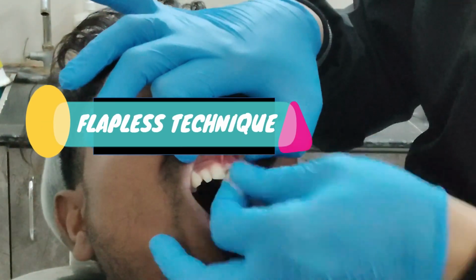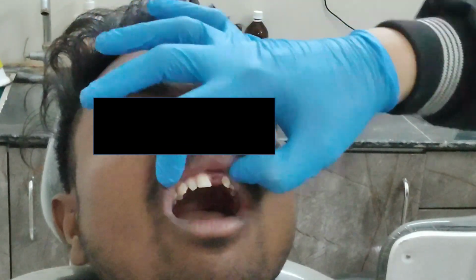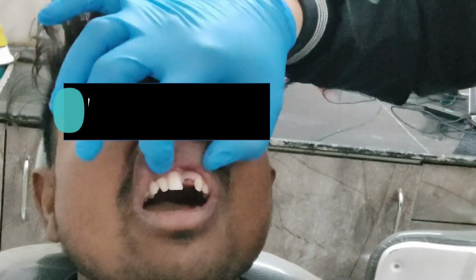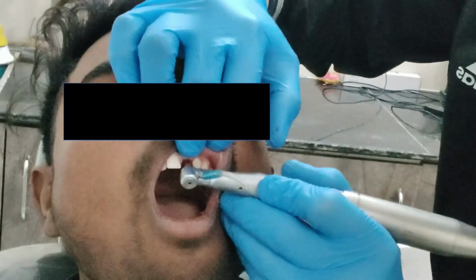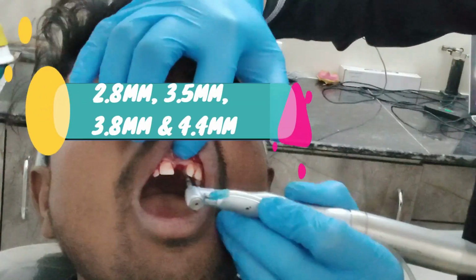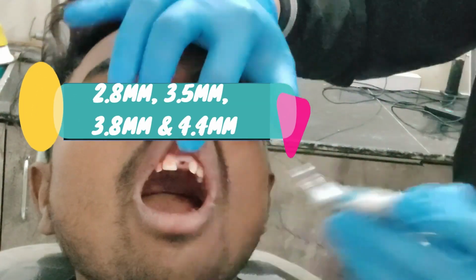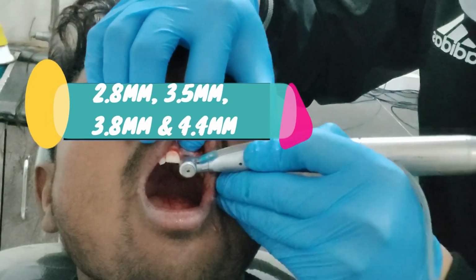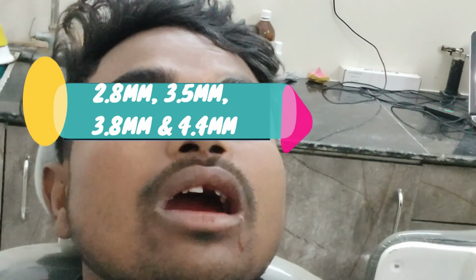Now we are going to start the surgery. We are using a flapless technique, so we are not going to raise any flap. We'll start our osteotomy with the first drill, which in this case is 2.3 mm in diameter, as you can see in the video. Now we continue the drilling sequence with 2.8, 3.5, 3.8 and 4.4 mm drills. So we are going to use a 4.4 drill in this case because we are choosing a wider implant.